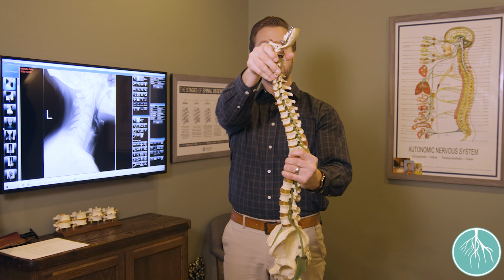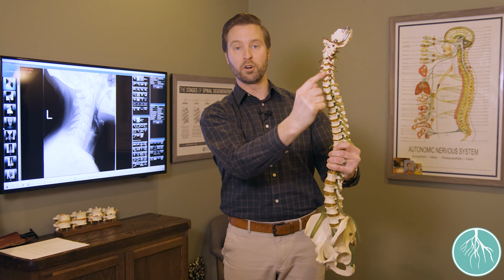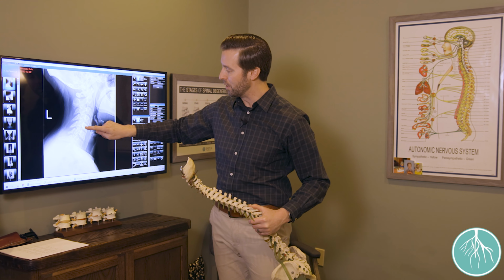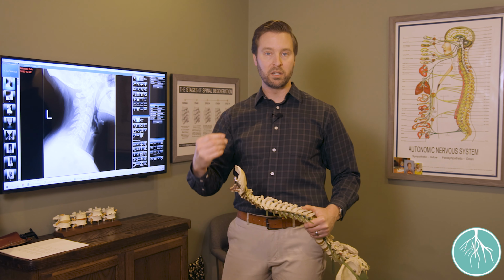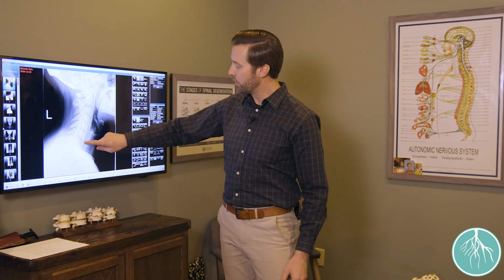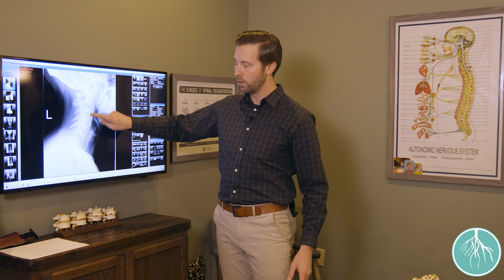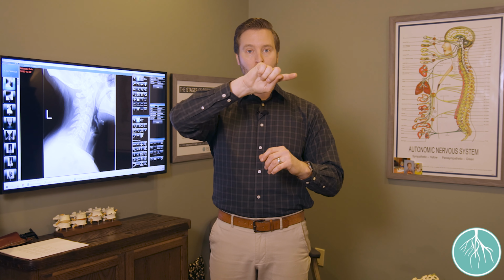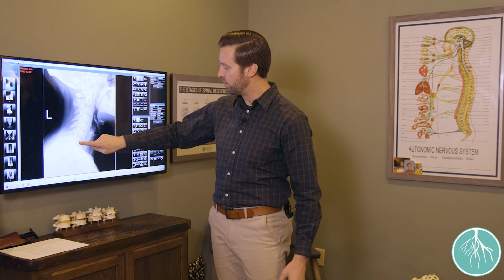When that neck straightens out, these cervical vertebrae have abnormal stress on them, and what begins to happen is the bones will begin to develop degenerative changes. So looking at the film, what the bones should look like, each vertebrae should look like an ice cube. So it's basically like a square/rectangle shape with rounded edges, nice smooth borders. That's what we should be seeing on the film.